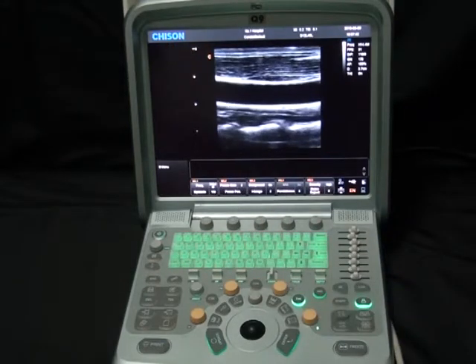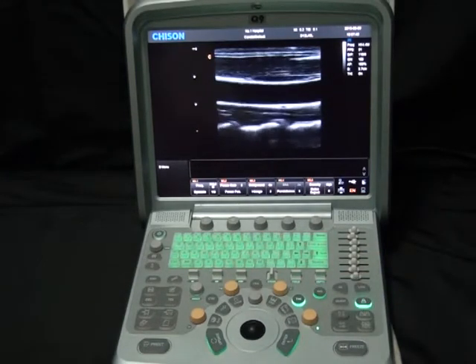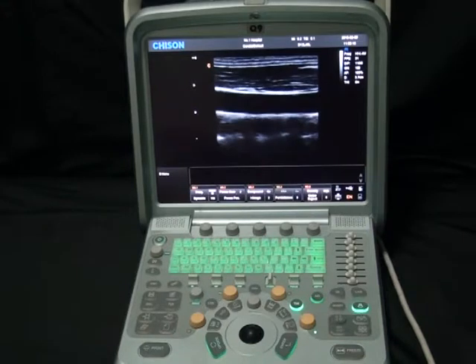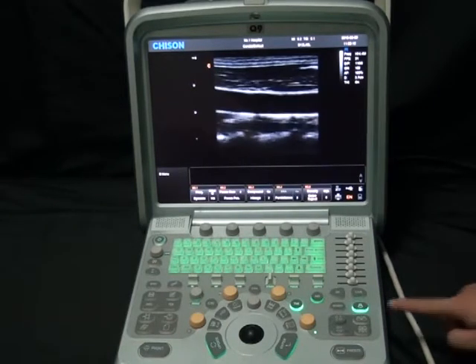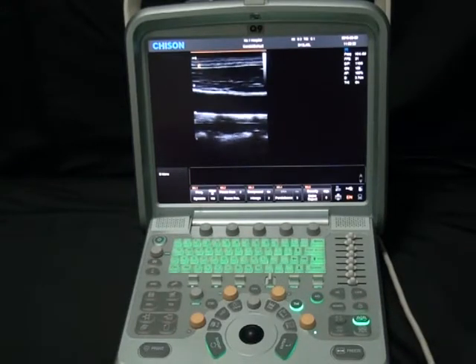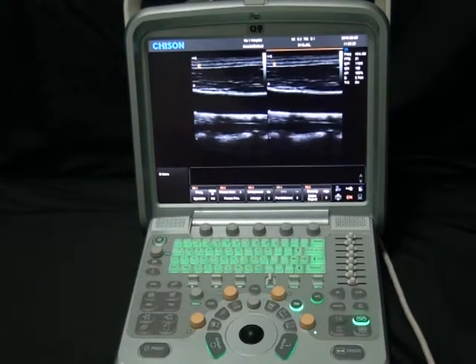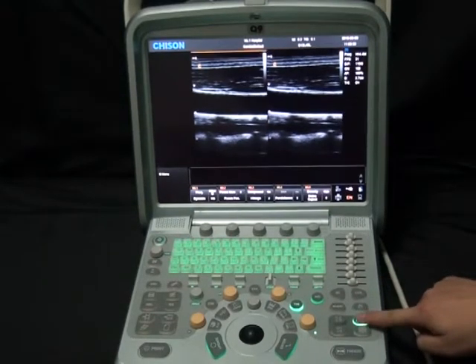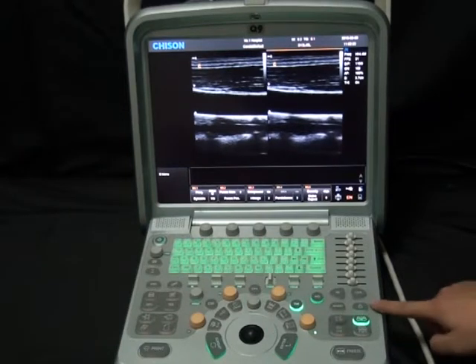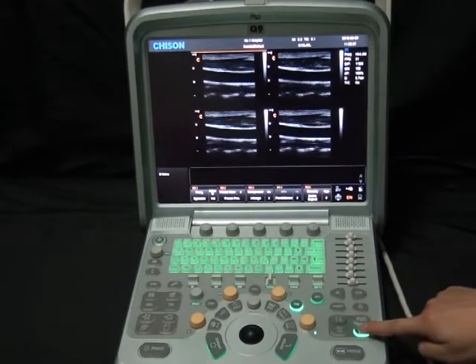What's more, as I mentioned before, one key to optimize the image is available. Press AIO. With just one key, the quality of the image can be in a suitable status. What is worth mentioning is that we have 2B mode and 4B mode. For example, 2B mode. With dual screen, click for the first and get one active. Push it again and the next become active. Back and forth allows you to switch between those. Push on the single key to go back to the single B mode. Same works for the quad screen.